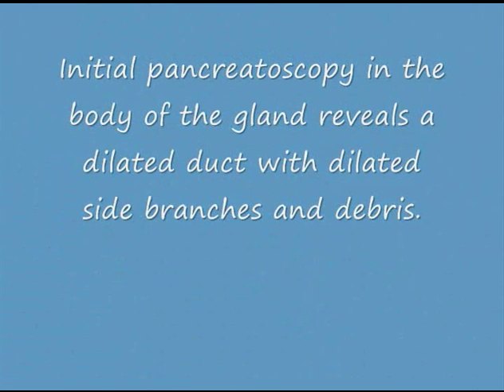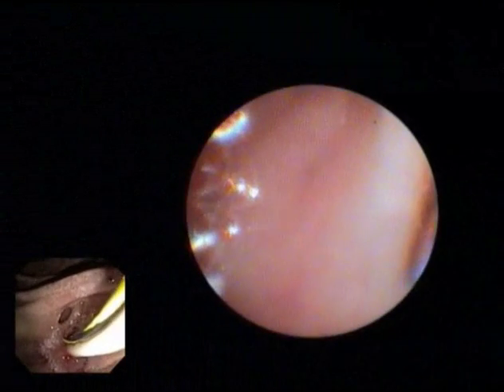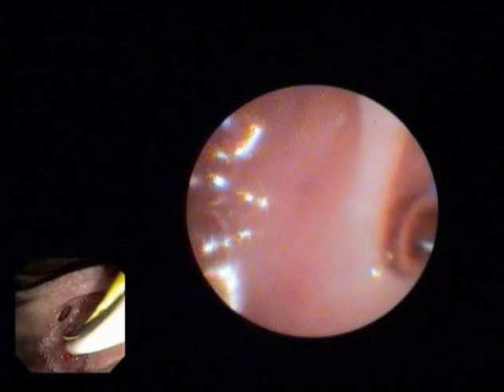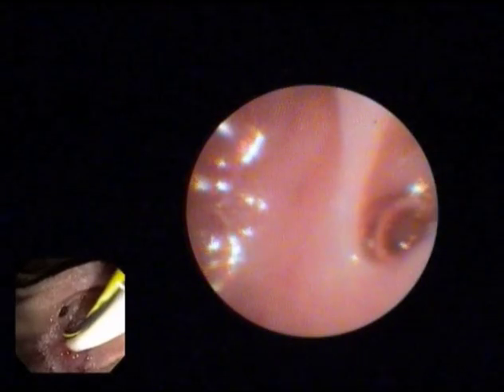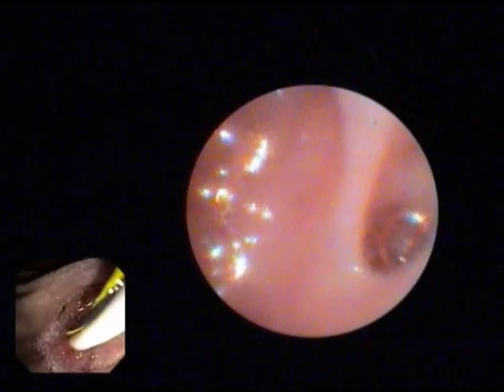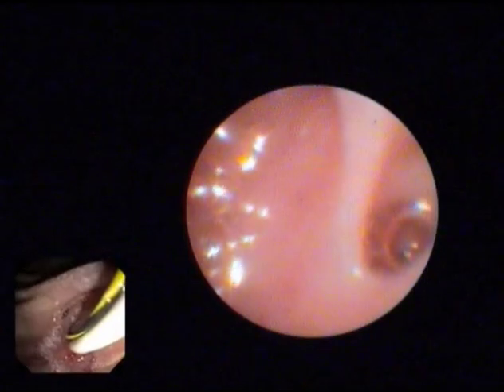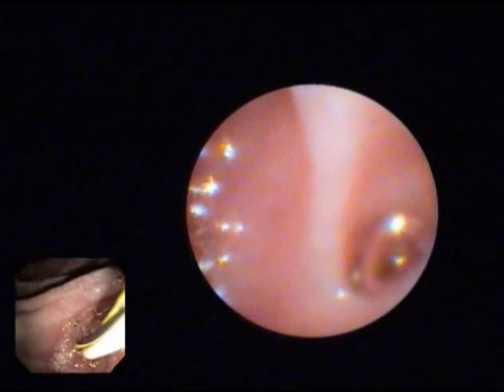Initial pancreatoscopy in the body of the gland reveals a dilated duct with dilated side branches and debris. Here you see a very generously dilated pancreatic duct lumen with a grossly dilated side branch containing an air bubble.